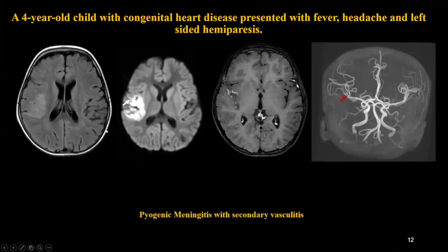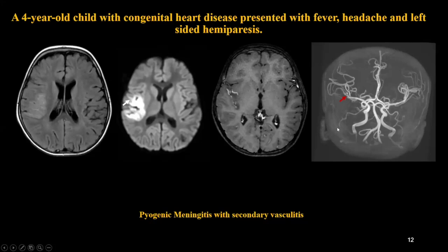This 4-year-old with congenital heart disease presented with fever, headache, and left-sided hemiparesis. Unlike developed countries where pediatric stroke is most commonly vasculopathic or inflammatory, in our country it is most commonly infectious. On the FLAIR image, there is hyperintensity along with diffusion restriction in the territory of insular branches involving the posterior insula. Post-contrast shows enhancement along the right sylvian fissure. MR angiogram, which I always perform in meningitis patients, shows irregularity in the insular branches of the right MCA — a case of pyogenic meningitis with secondary vasculitis, which is not uncommon even in pyogenic meningitis.